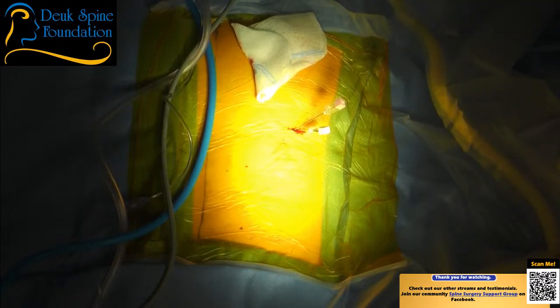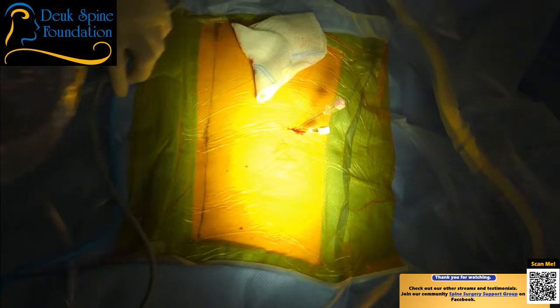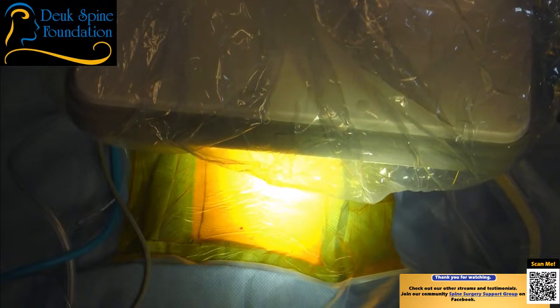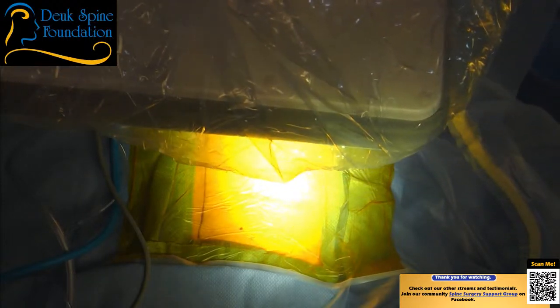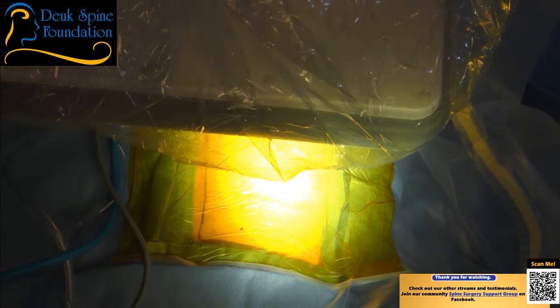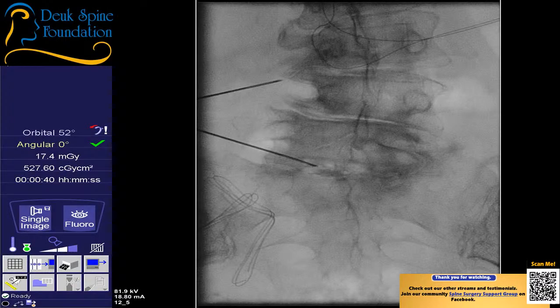All right, so let's get an AP. So now we're at the 3-4 disc. We're fixing 3 discs in this patient: 3-4, 4-5, 5-1. We got lucky. We got into 5-1 nicely. All right, so we're too far lateral. We need to go more medial for 3-4. All right, so let's go back to a lateral.